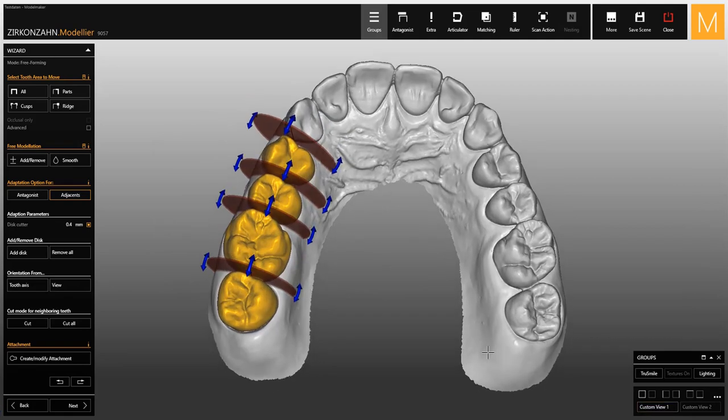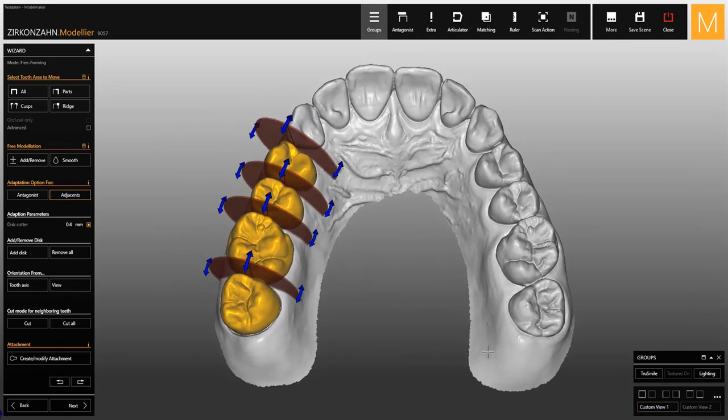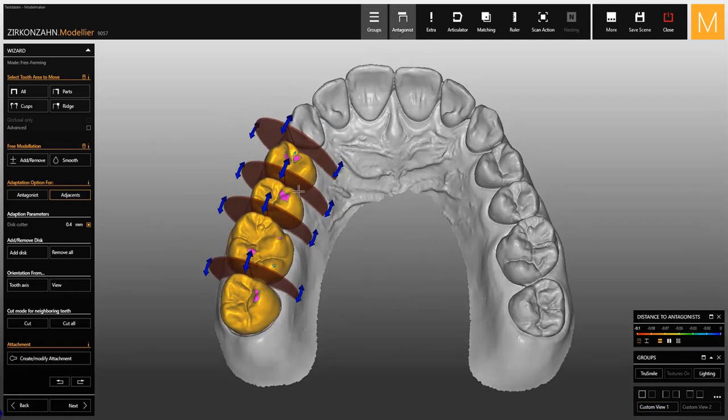You can now proceed with the cutting. If there are intersections with the antagonist, you can cut them too by selecting 'Cut All'.